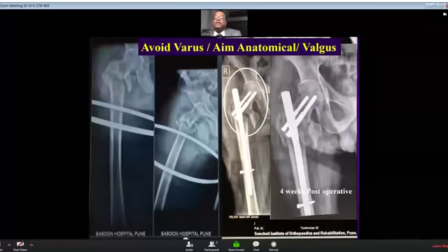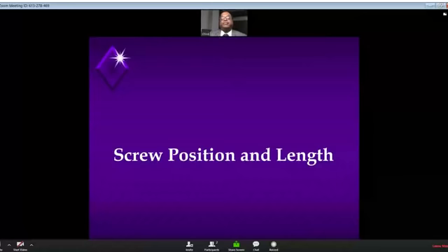You can see beautifully the fracture is already consolidated. So this is the thing which you learn: if there is a void medially, you should try to get a valgus reduction. If I had not obtained a valgus reduction in this case, it would have gone into failure. So getting valgus reduction is very important, and getting the neck screw or the cervical screw subchondral is equally important in these types of cases.